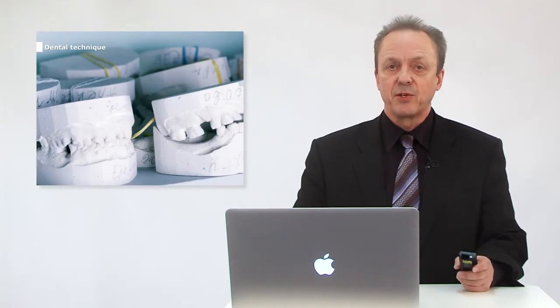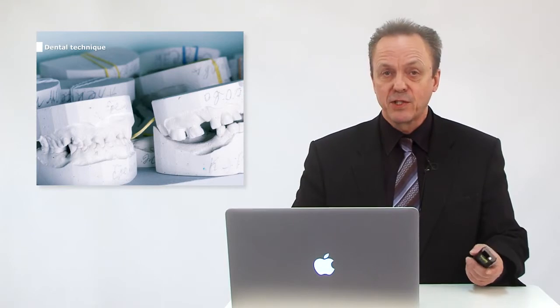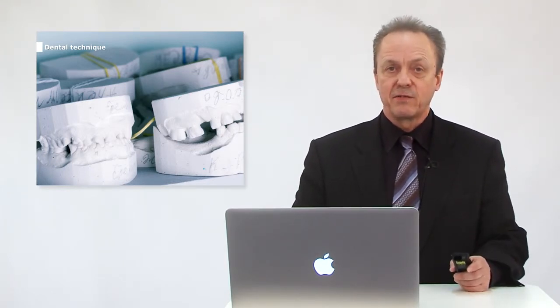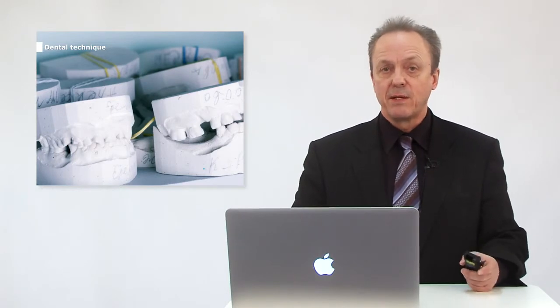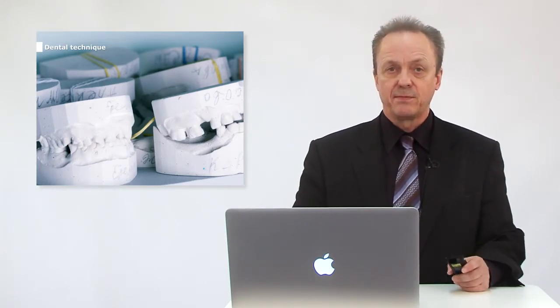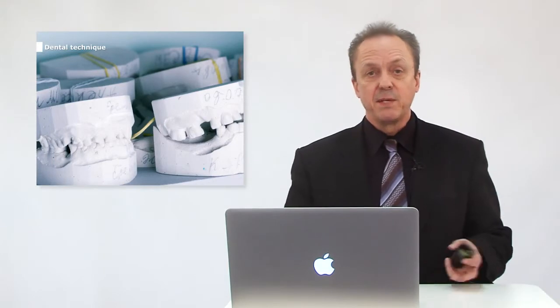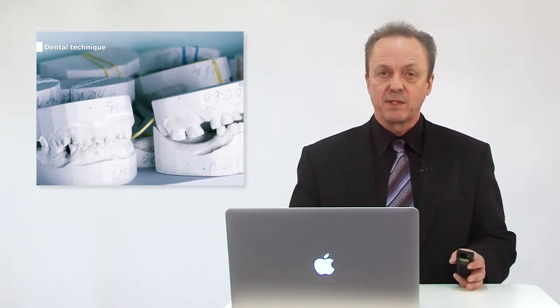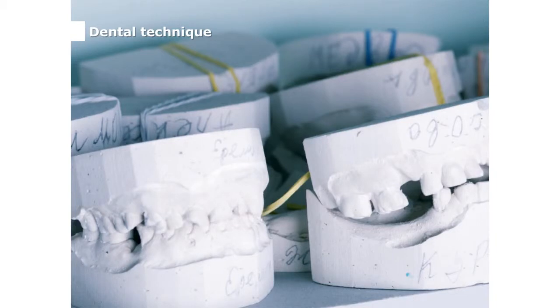To produce the gypsum model, watery suspensions of gypsum are used. If these come into contact with a hydrophobic surface, the gypsum may not be able to fill all areas. As a consequence, we see bubbles or voids in important areas like the preparation margins. Therefore, with its hydrophilic properties, Honigum Pro also supports the dental technicians.